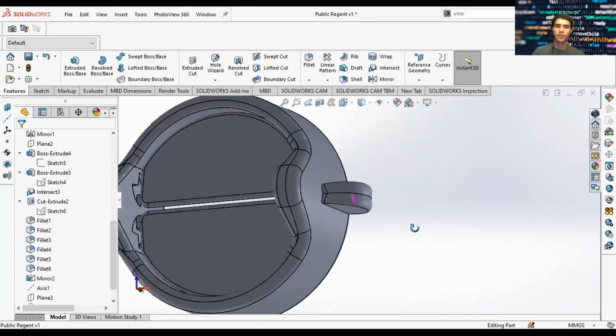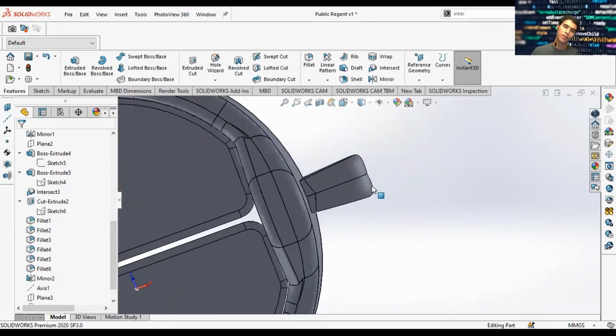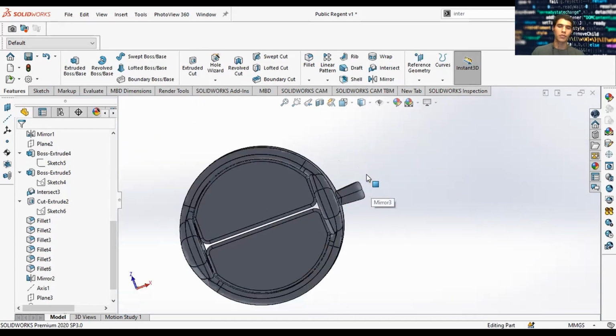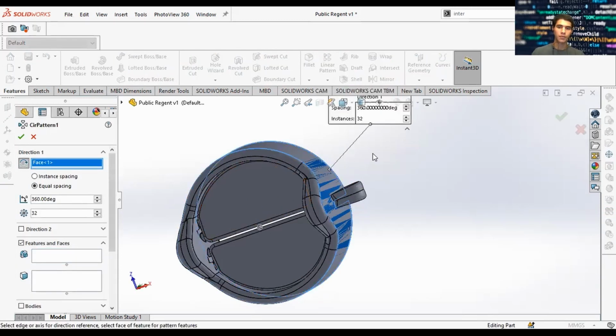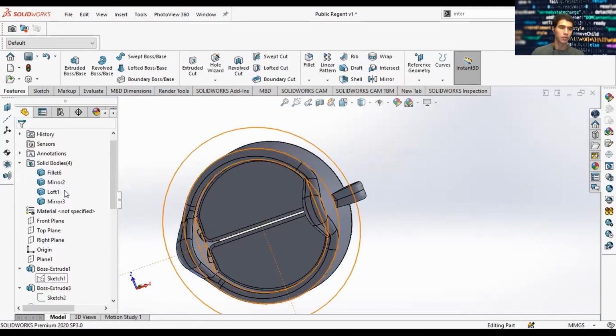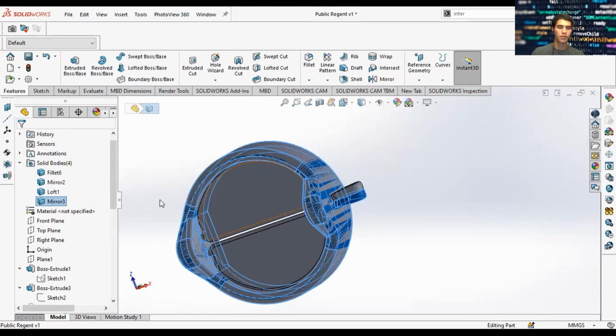All right. So see how we have our loft now? It was kind of like a cuff, almost. So what's more missing now is we're going to do circular pattern. Circular pattern is going to allow us to revolve all of this around 2, 4. Gotcha.